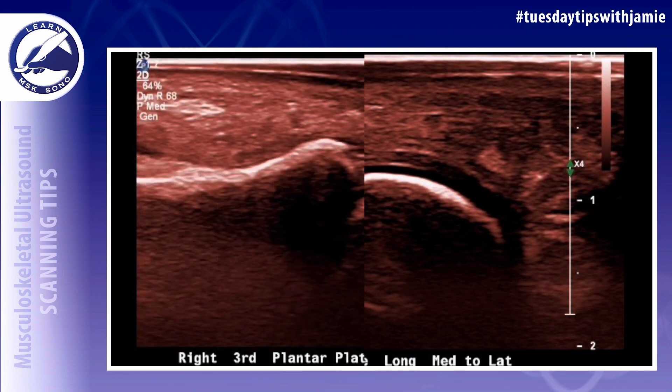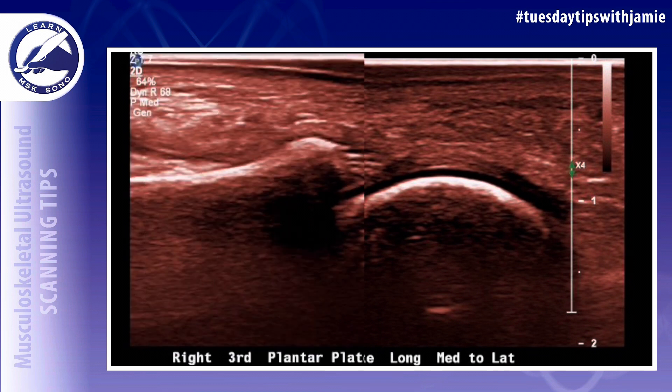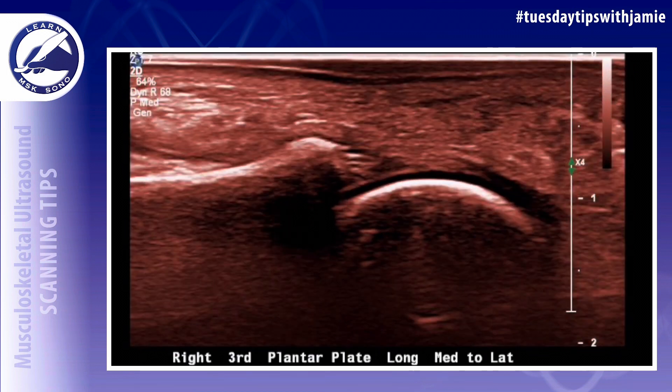Second, place the transducer on the plantar aspect of the base of each toe. Third, have the patient dorsiflex their foot so that their foot and toes are straight, but have them keep their foot relaxed enough so that you can still manipulate it manually.